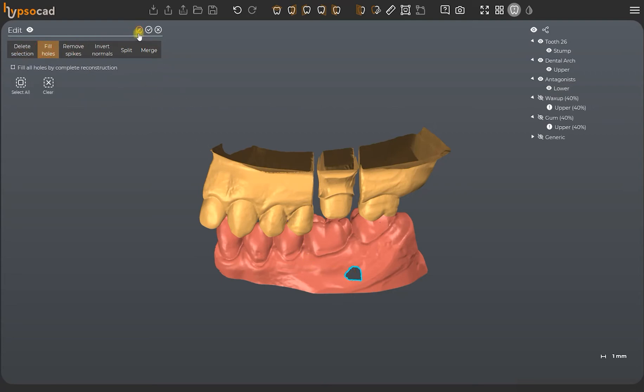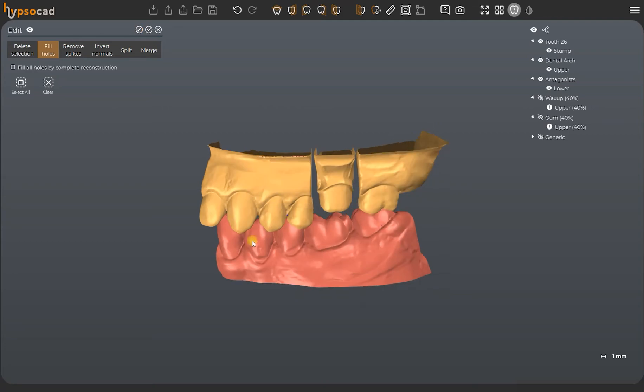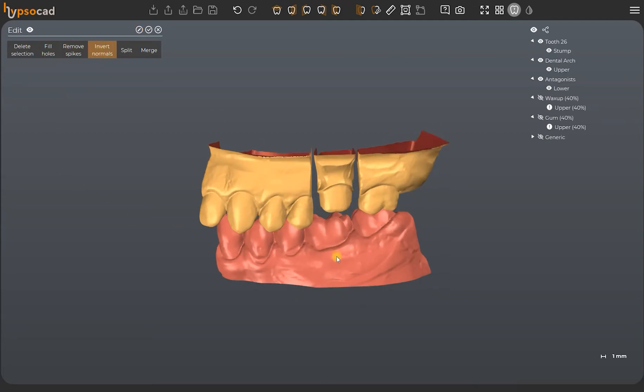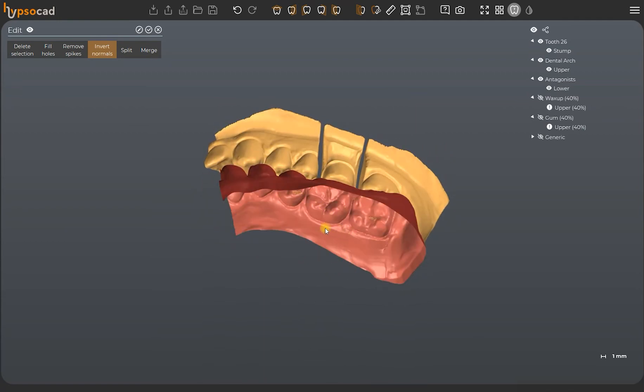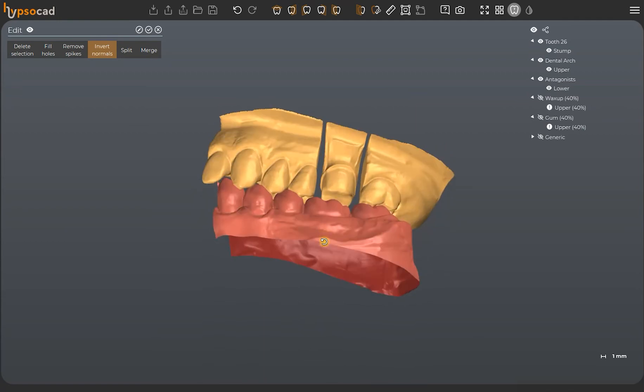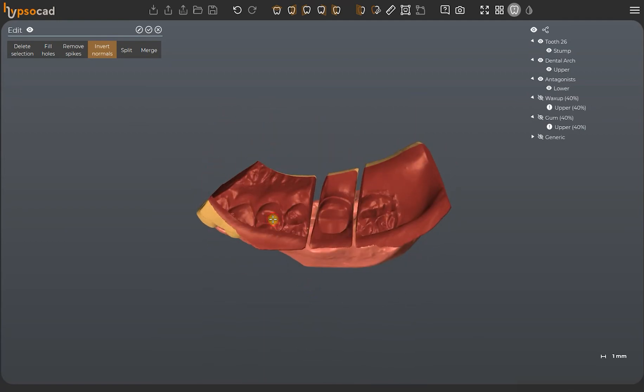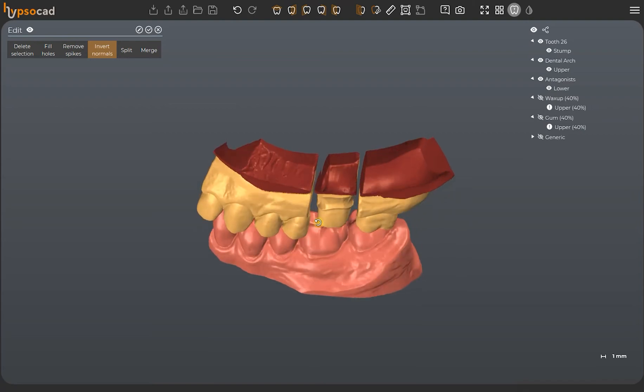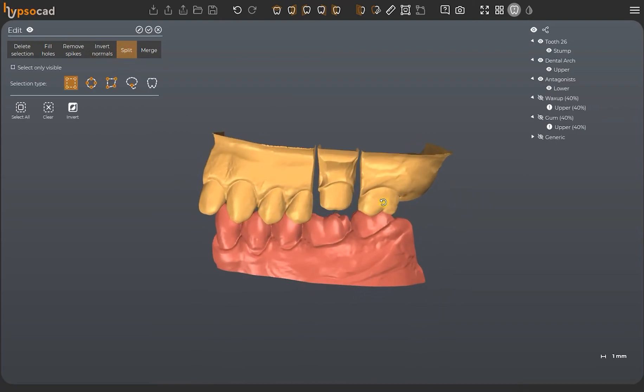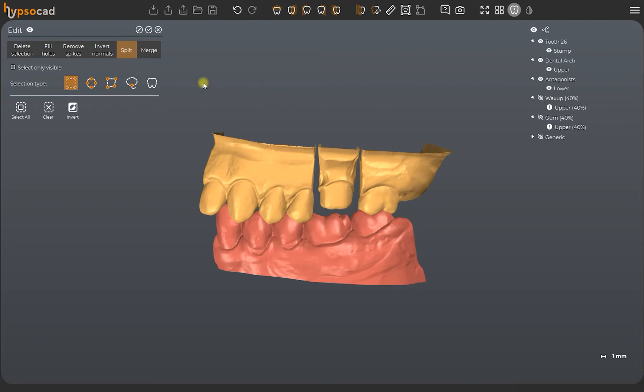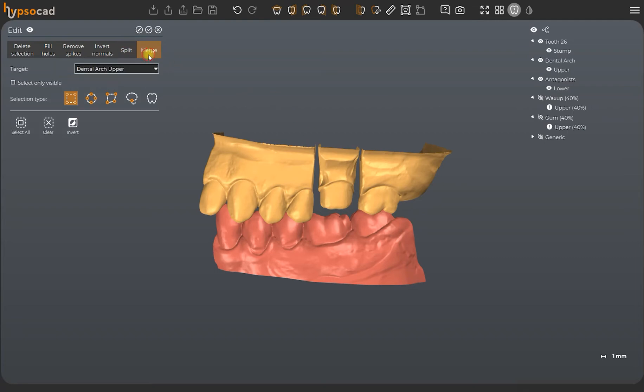You can refine the mesh, invert normals, separate and combine the clusters. Below, we have the selection tools that help us isolate the different parts.